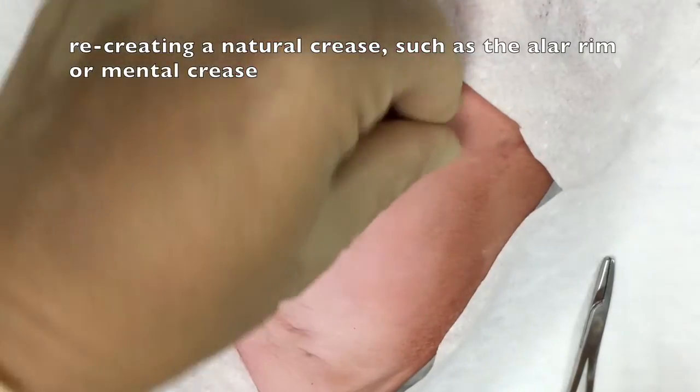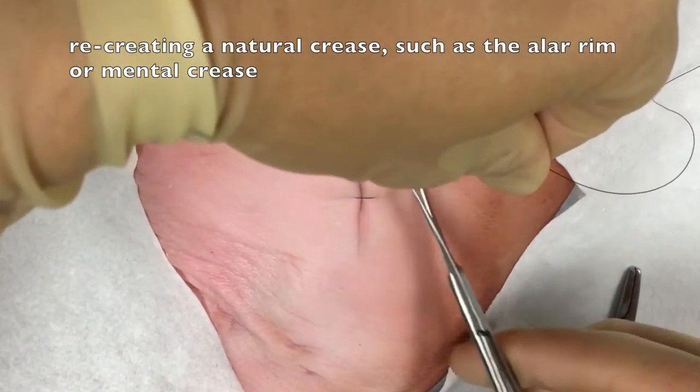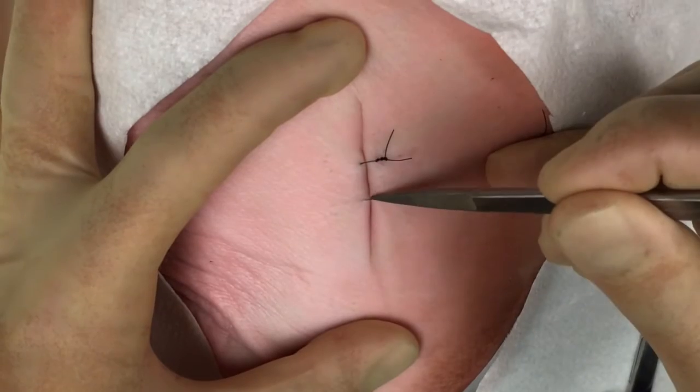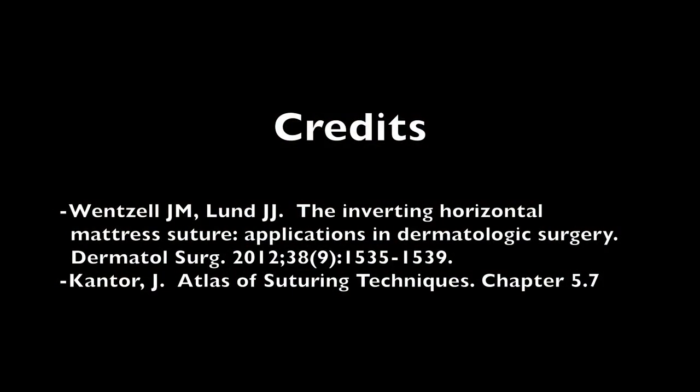For example, when you're trying to recreate a natural crease, such as right next to the nose, the alar rims, or perhaps the mental crease in a laceration of the chin. Here you see that marked inversion is created by the inverting horizontal mattress suture — a niche technique.